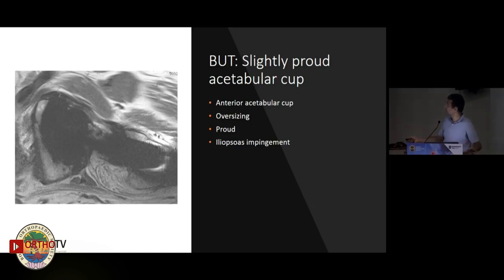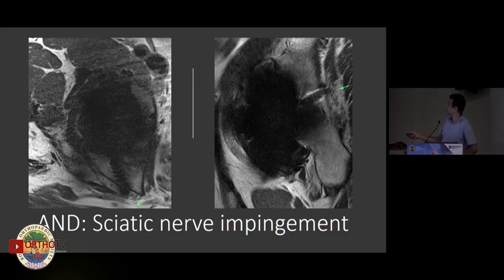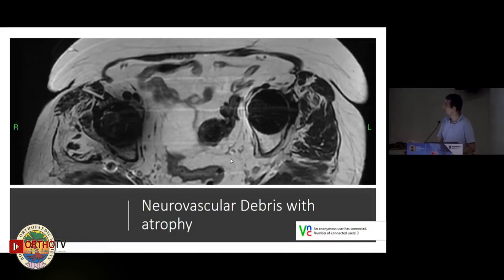When we get a good MR image, we can see here an oversized cup impinging on the traversing iliopsoas muscle anteriorly. In this case, you can see a screw projecting posteriorly right next to the sciatic nerve, visible on both sagittal and axial images. You may even be able to see a neuroma forming along that region. We can also see metallic artifacts in the region of the sciatic nerve with associated muscle atrophy.